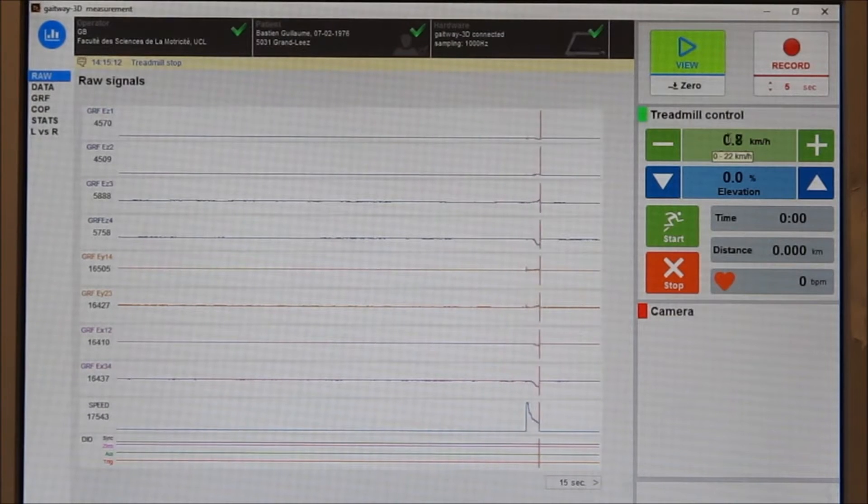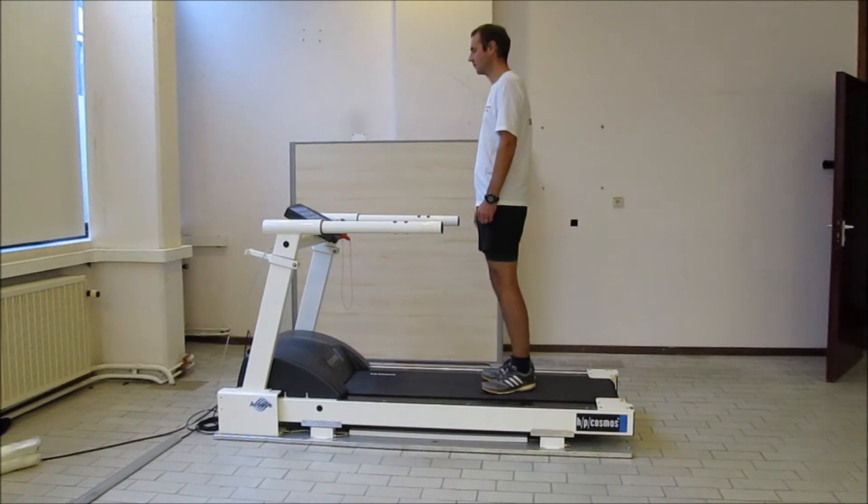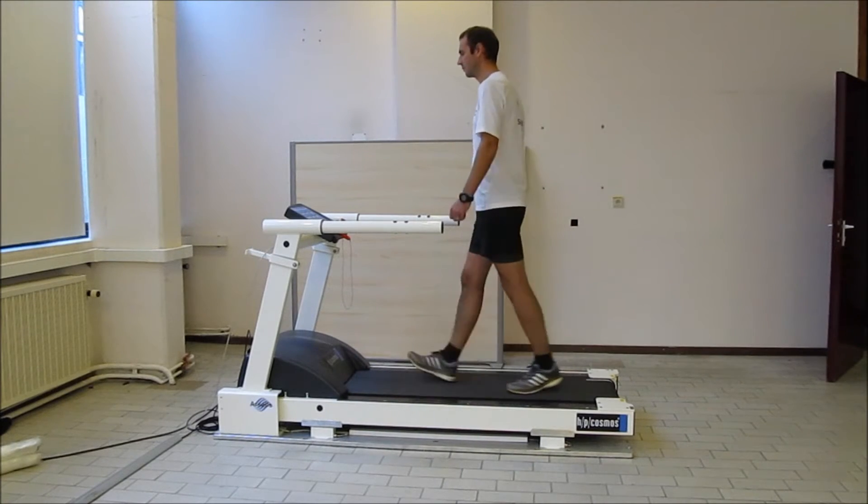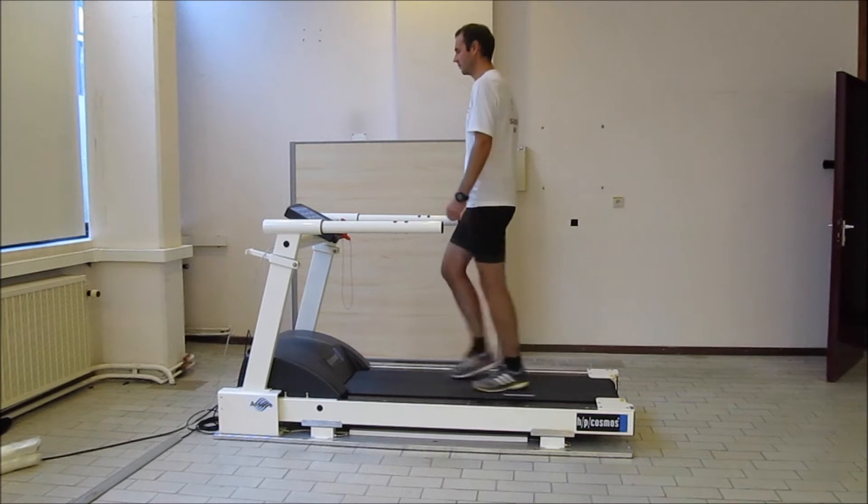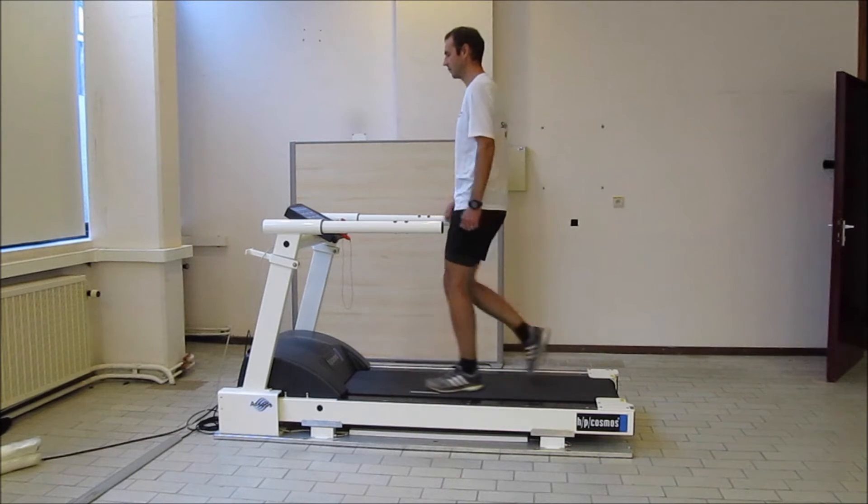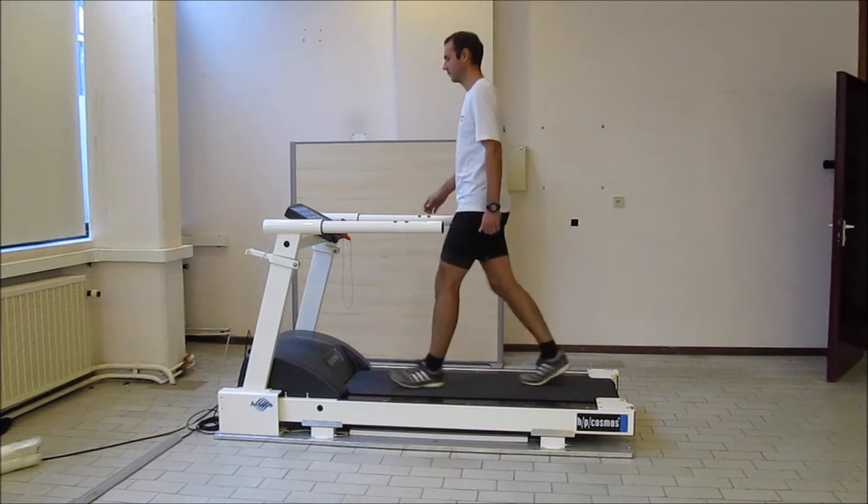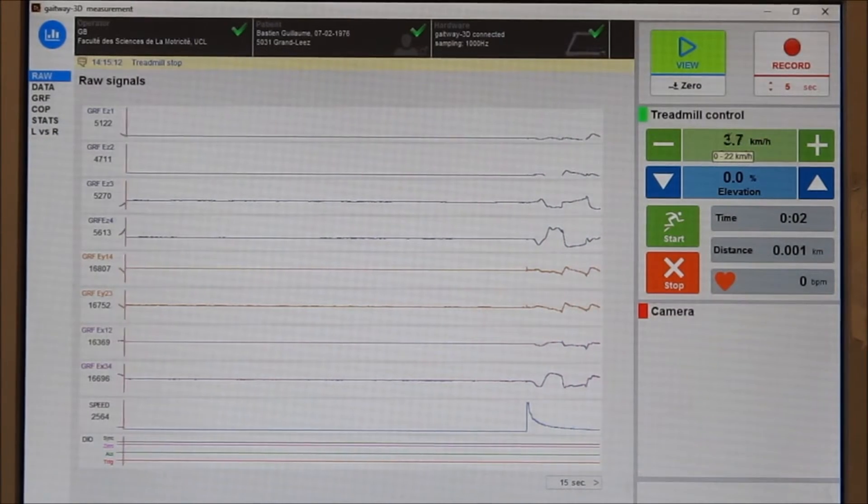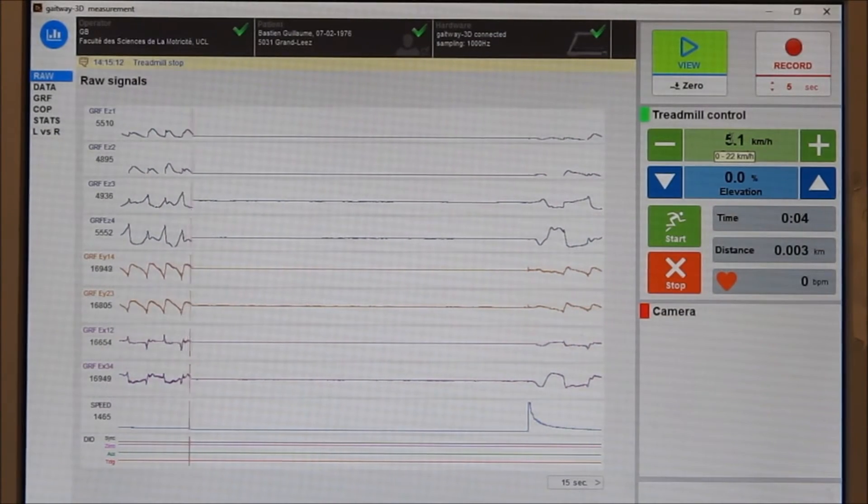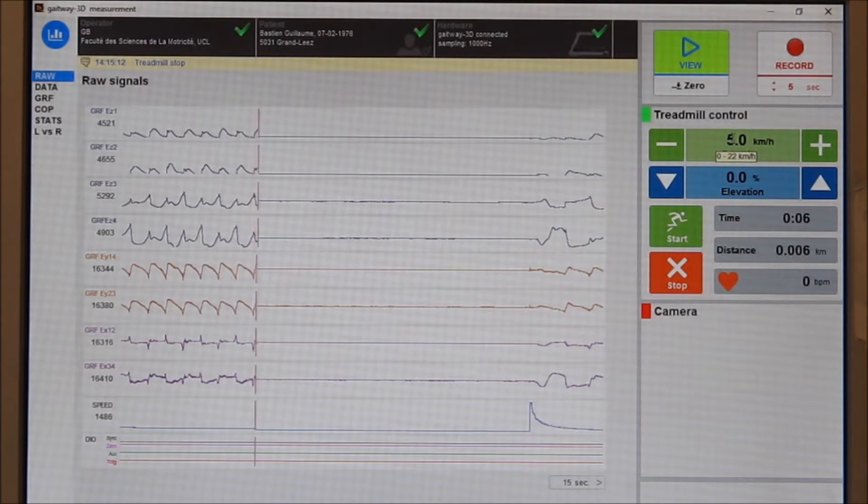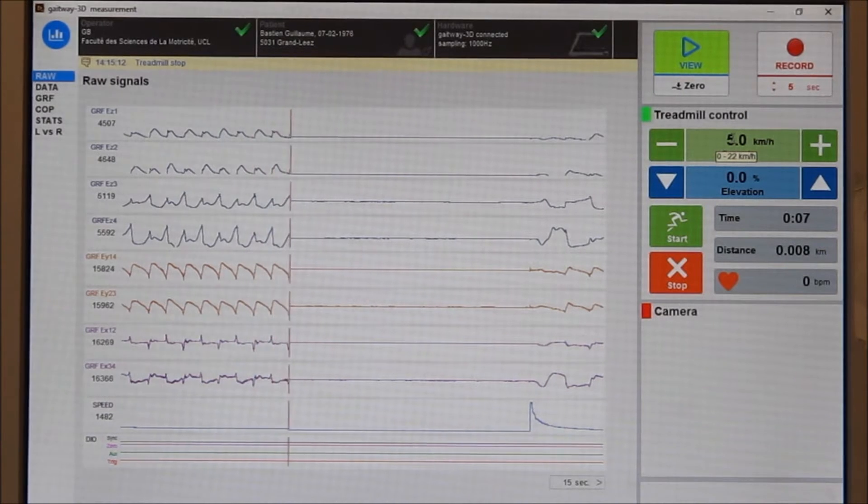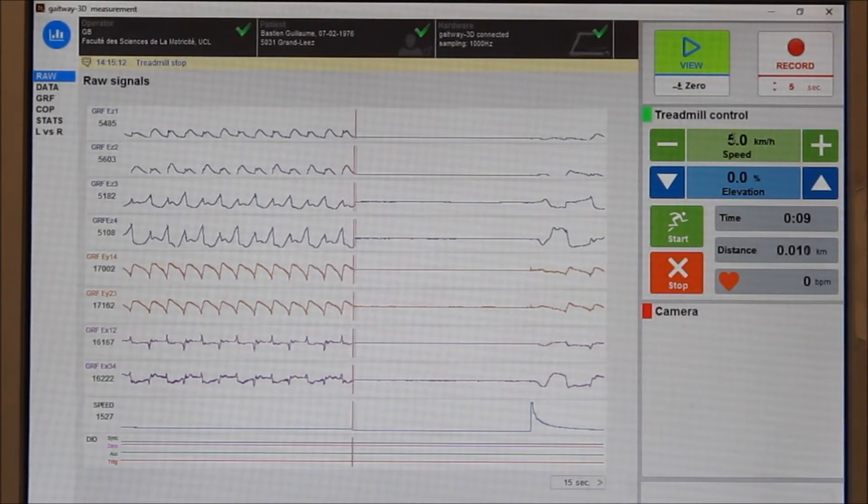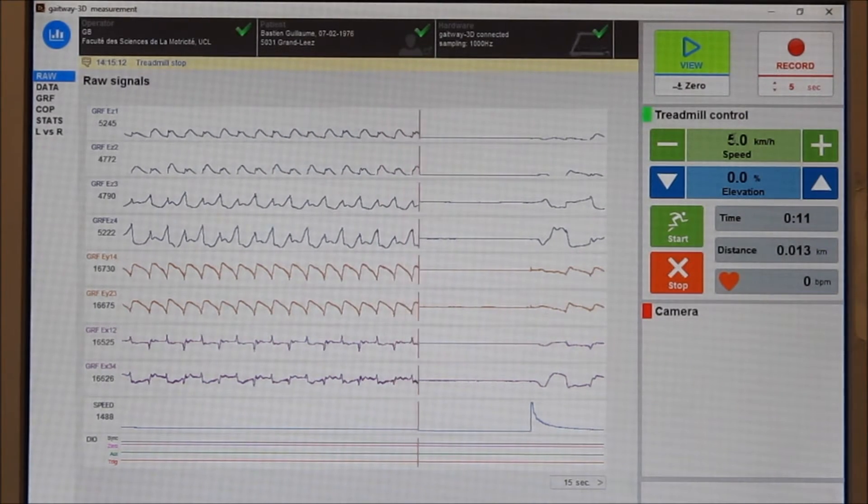The treadmill can be controlled from any screen during the measurements. The software allows control of the treadmill speed and elevation and reports exercise time, distance, and heart rate. The first panel shows the raw data in bits as sampled from the A2D converter. This includes 8 force signals, 1 treadmill speed, and 4 digital signals.